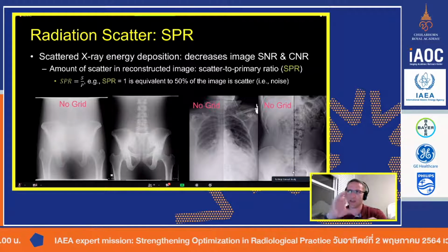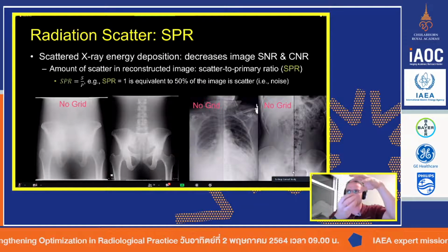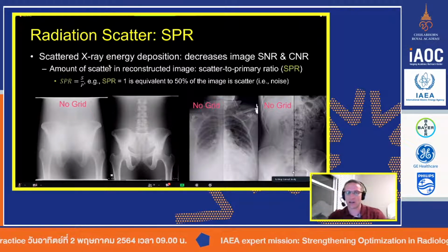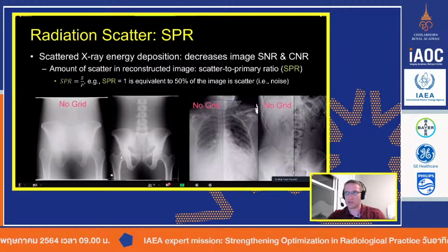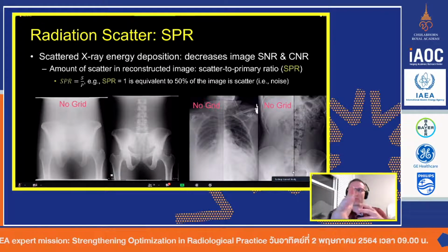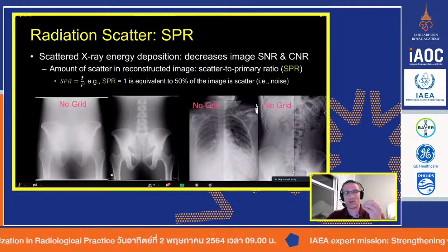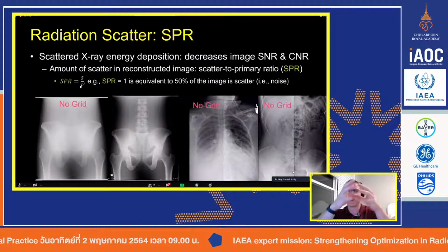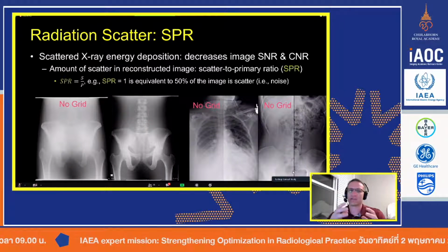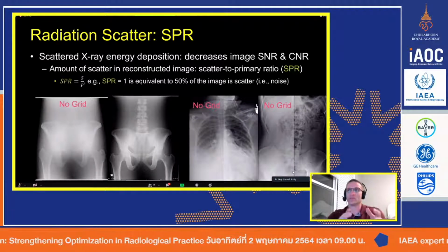And now if you change your kV and go higher, then you have the potential for more scatter. So now your scatter will go up and your primary may go up, but not as fast. If you change to a lower kV, you're going to get a lot more absorption in the bones, which is a good thing. So now the bone will stick out a little bit more. But if it's a big body, then very few of the photons are going to get through. So even though you'll have a little less scatter because you get more absorption, you'll actually have a lot less primary because the photons are just not getting through the body. That's the hard reality of trying to get the right photons through and reduce the amount of scatter. And that is why we use anti-scatter grids.